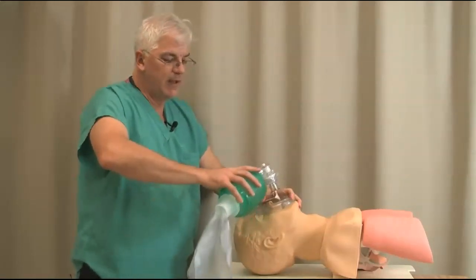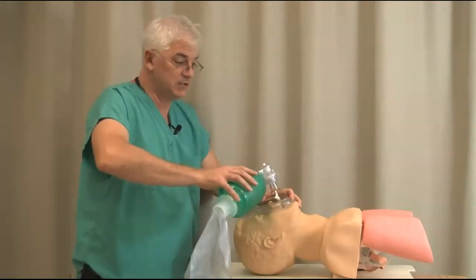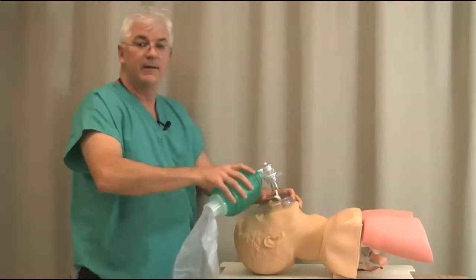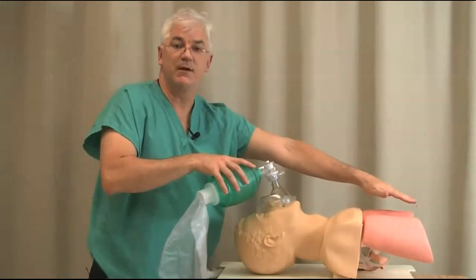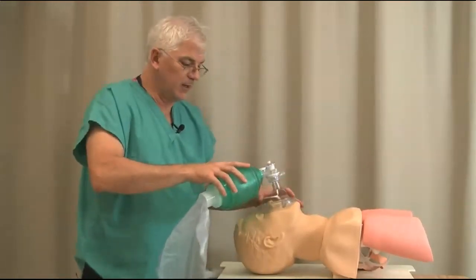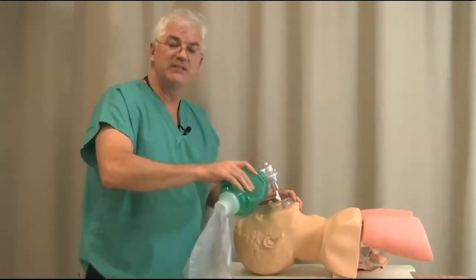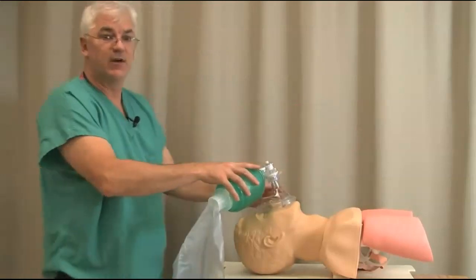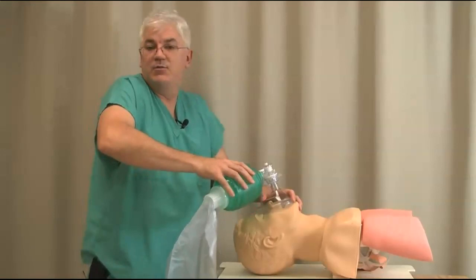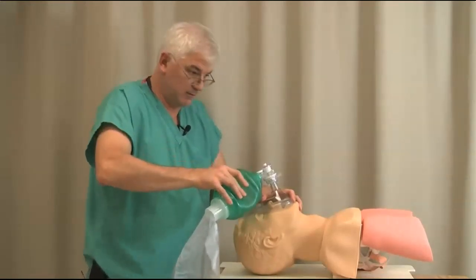When you squeeze the bag, notice I'm going to do gentle ventilations. If I go like this, I'm going to probably push air into the stomach. This is no way to ventilate. Also, the literature on CPR has told us that hyperventilation impedes venous return and worsens outcome when it comes to resuscitation. So how many times do we breathe? We breathe maybe 10 or 12 times a minute. That's the way you want to breathe.